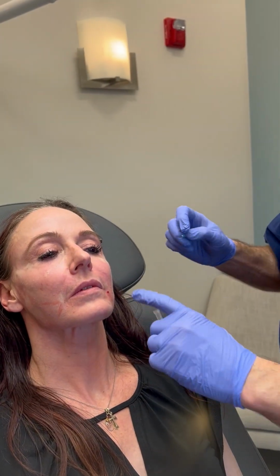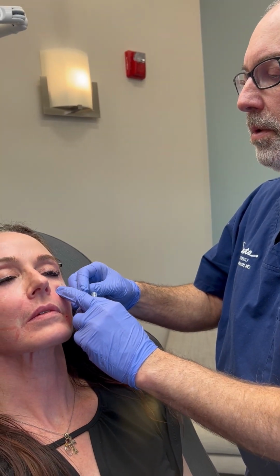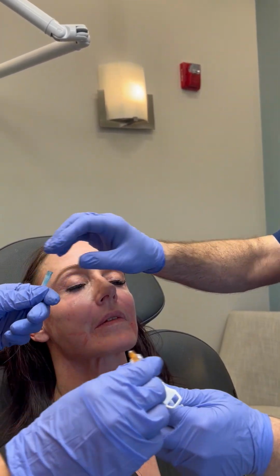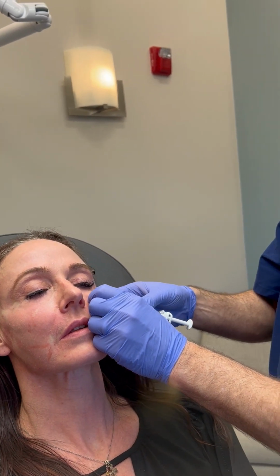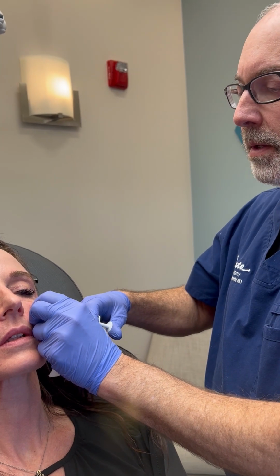I blend my Restylane 1-to-1 with saline. It helps to prehydrate the product so we see less swelling afterwards. Restylane's still the best product for the under eye. I'm using a cannula here, and we're staying, again, fairly superficial here because she doesn't have a very deep trough.